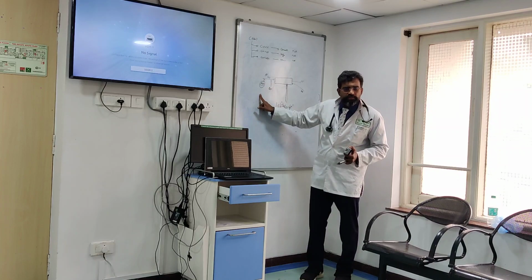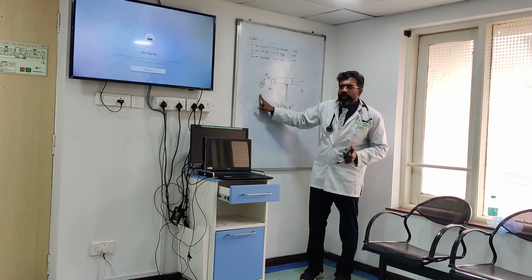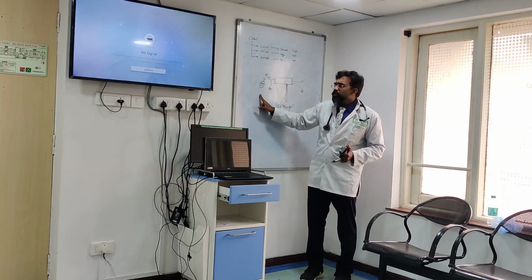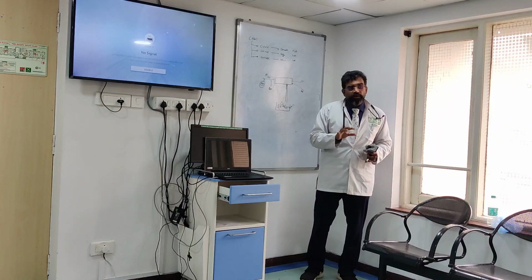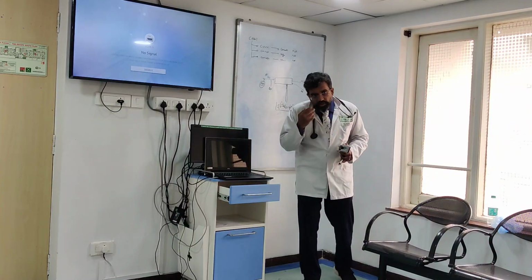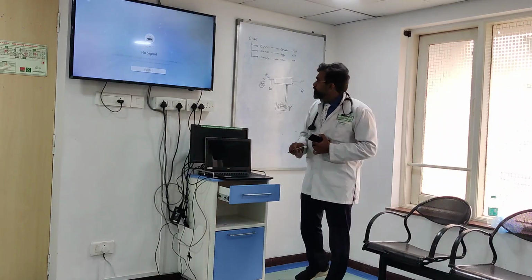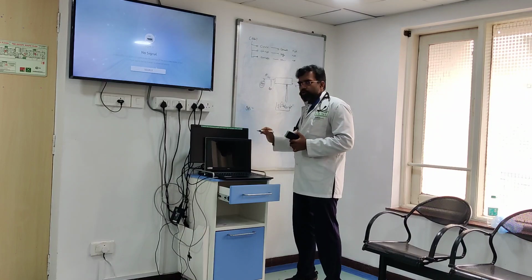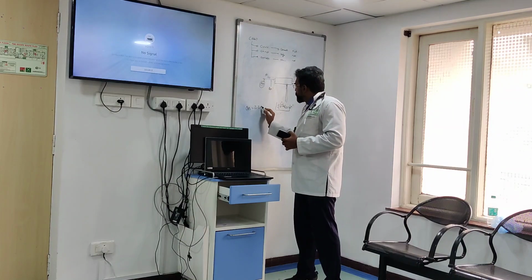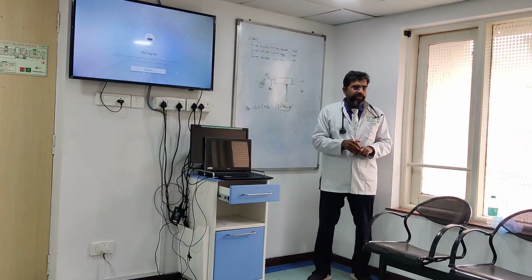You understand? In the first 2 hours nothing is going to happen. It is going to occur at 12 to 24 hours. It's an extremely slow modality, and that's why I need to ensure that the filter works very, very well. That means the filter does not clot. For the filter not to clot, there are few equations that you must remember. So what you must remember is my blood pump should be 2 to 2.5 times my dialysate flow, if I'm going to use CVVHD.